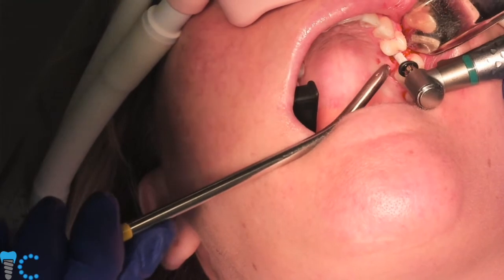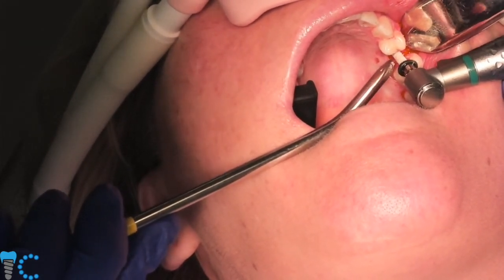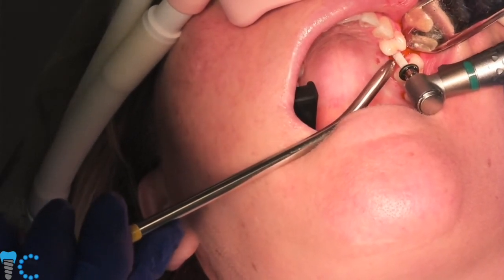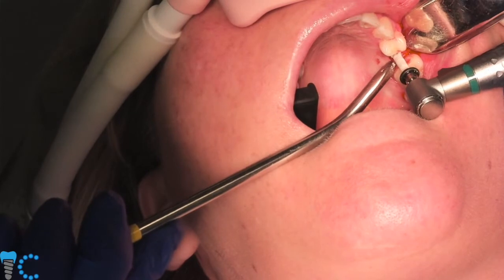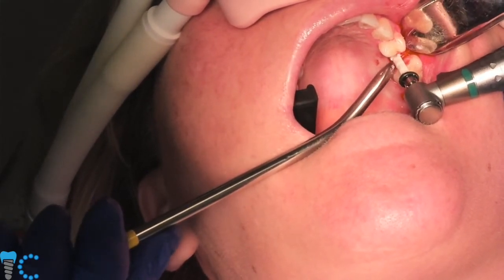And now, I'm hitting reverse, and now we're going to reverse the tap back out. So our handpiece gives us a little auditory confirmation that we're in reverse. So I can't see the numbers, but I know we're in reverse even before I see the direction. You hear it.